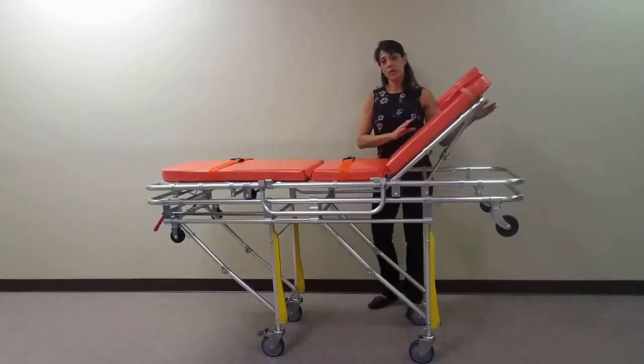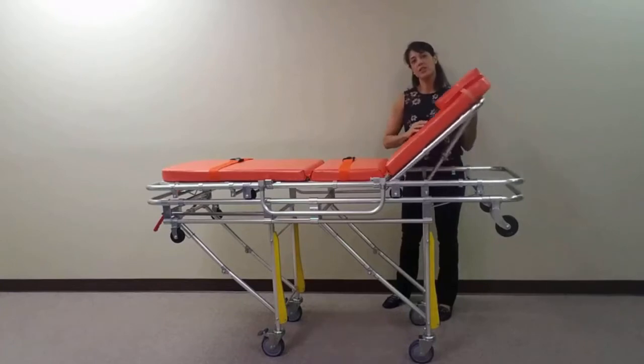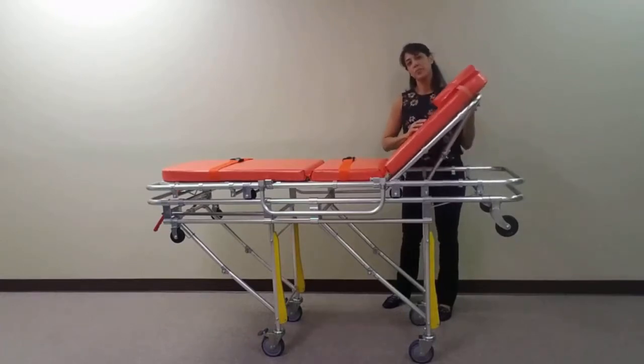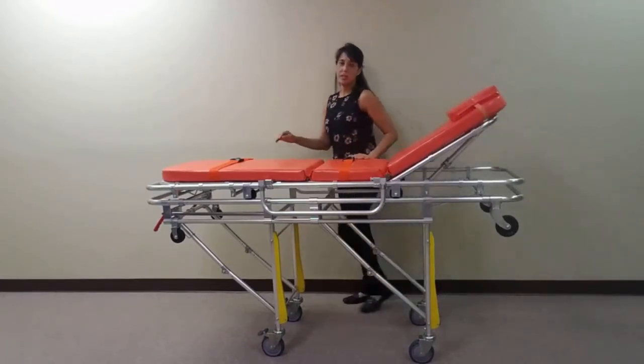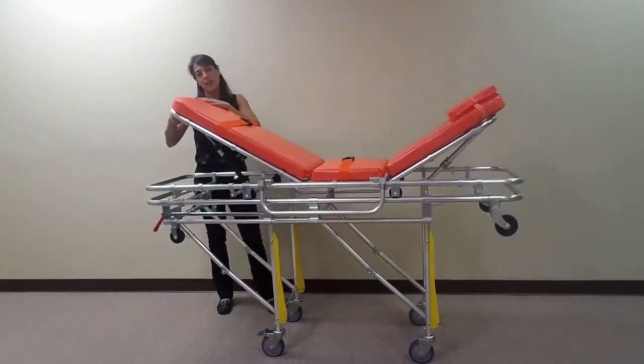To adjust the backrest, pull the red lever located on the back of the rest and adjust to the desired angle. To adjust the legrest, pull the black lever located under the legrest and adjust to the desired angle.